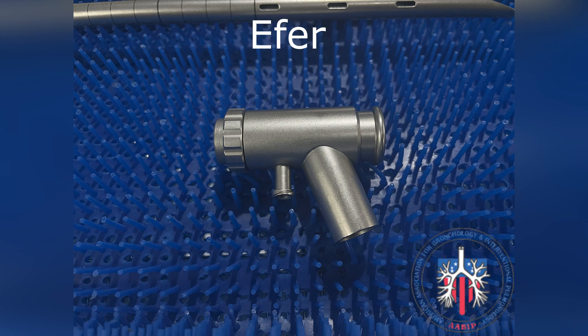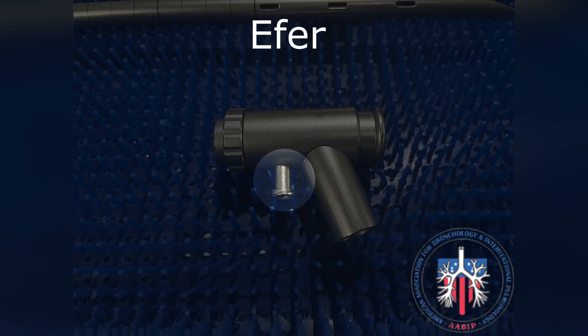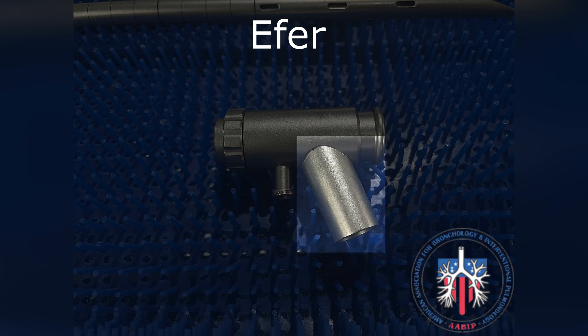This is the Efer built-in ventilator connections. Here is the connection for the jet regulator hose, and here is where ventilator tubing can connect for closed circuit ventilation.